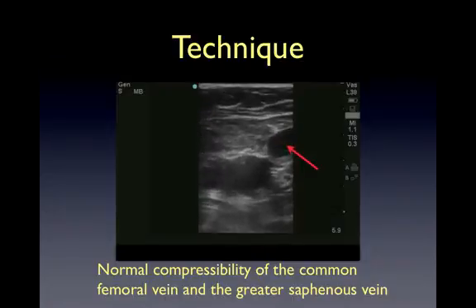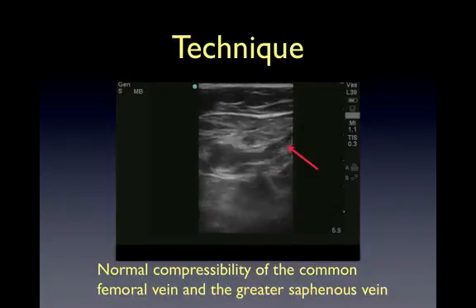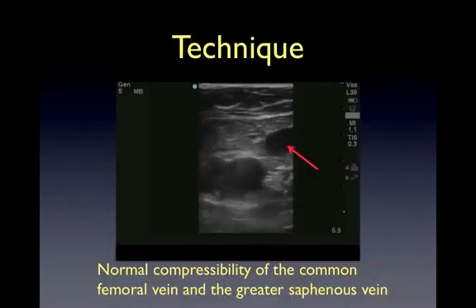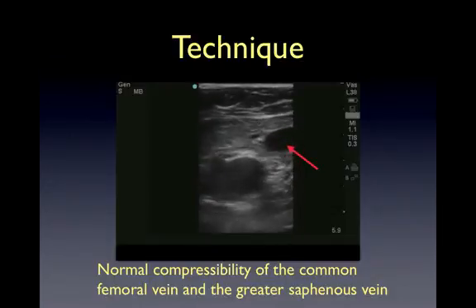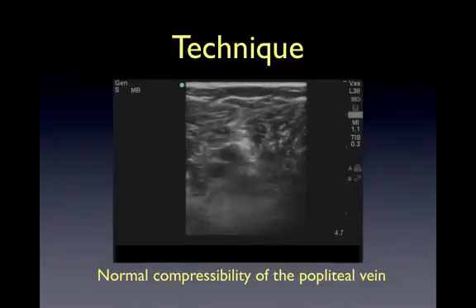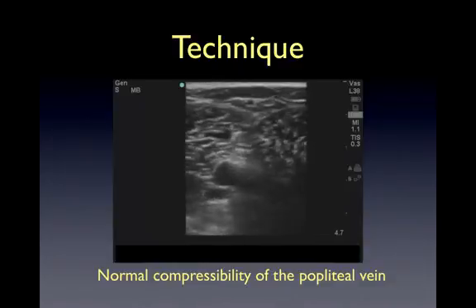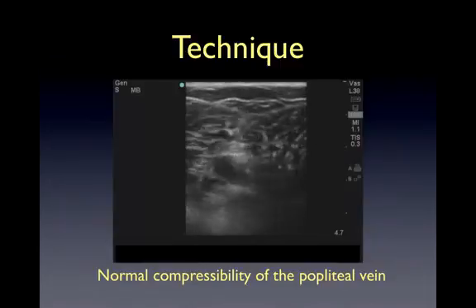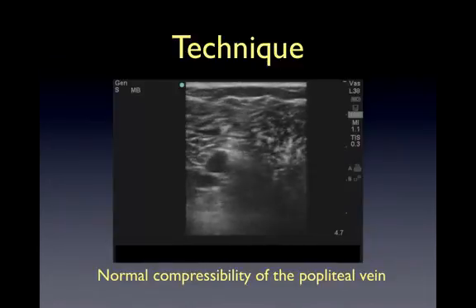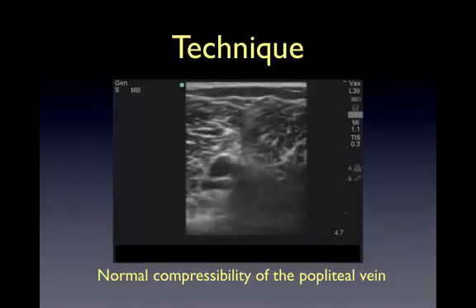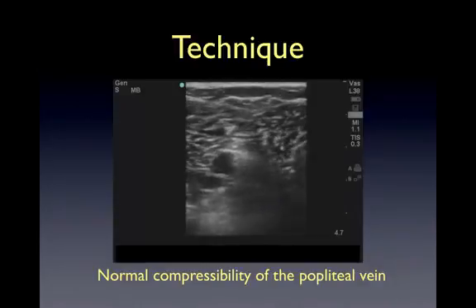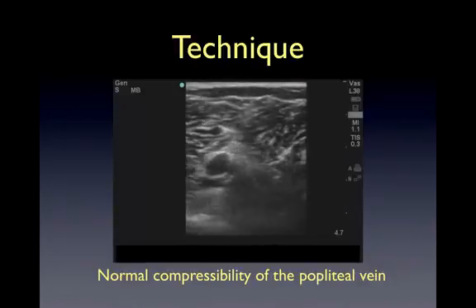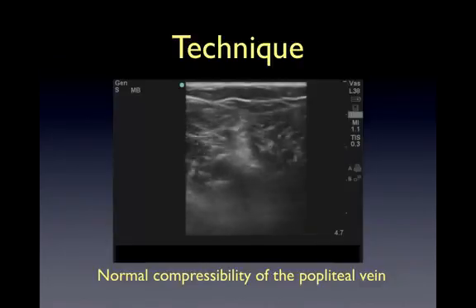This is a video of normal compressibility of the common femoral vein and the greater saphenous vein. Here you can see the anterior and posterior walls of the veins are completely touching. Scan distally along the popliteal vein in the popliteal fossa — here the vein is superficial to the artery, closest to the probe. Apply gentle but firm compression every 1 to 2 centimeters until the trifurcation of the popliteal vein. This is a video showing normal compressibility of the popliteal vein, where the anterior and posterior walls of the vein are completely touching.